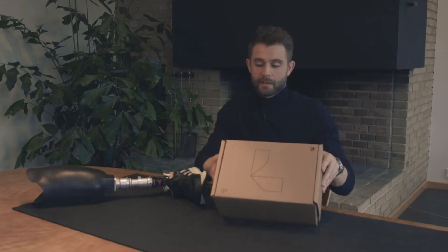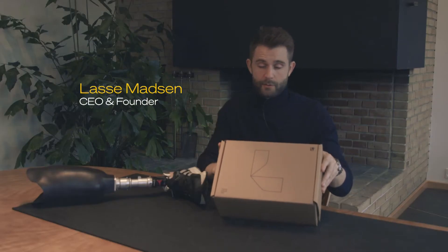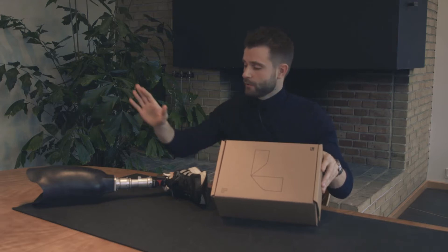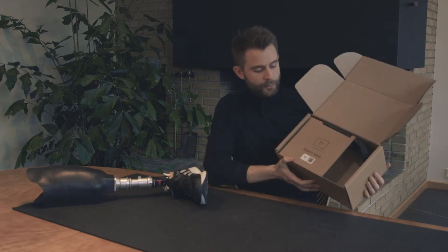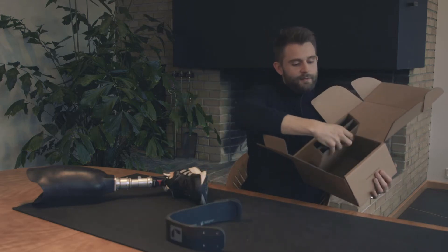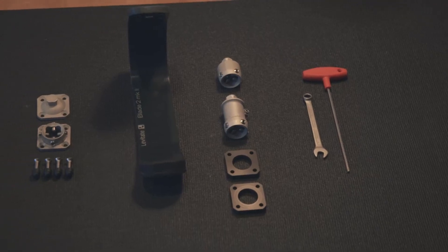In the box you have everything you need: the blade, the tools for installation, and all the components needed to install it to your existing socket. When you open up the box you will find the instruction video on how to assemble it. You will find your blade and all the tools that you need to install it.